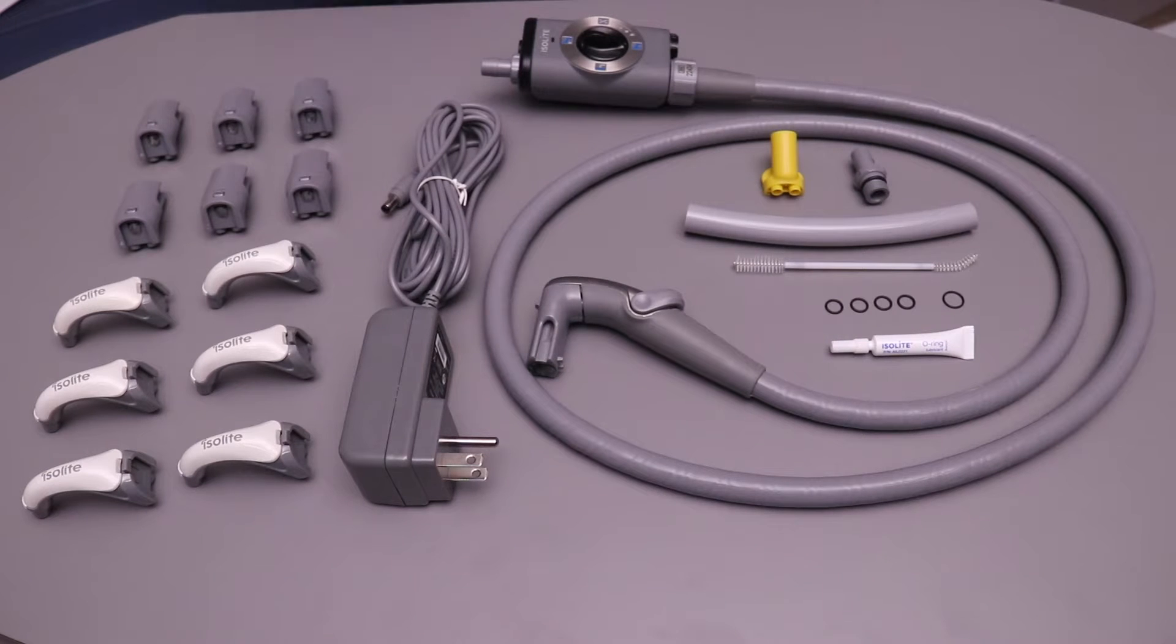The Isolite Pro solution comes with a control head hose, which is connected to the power vacuum base and the control head.